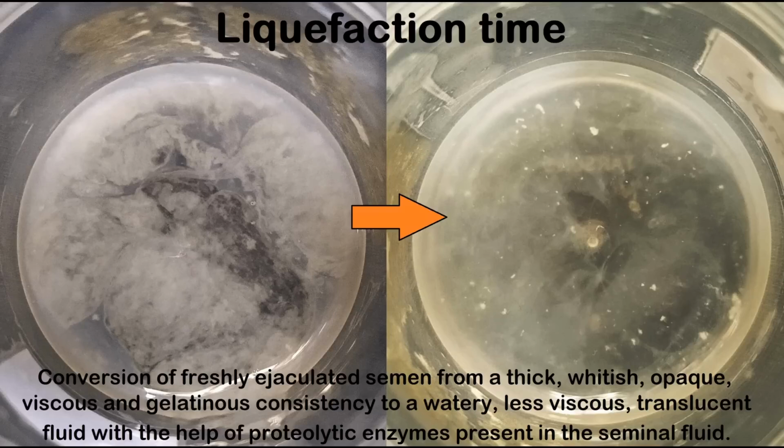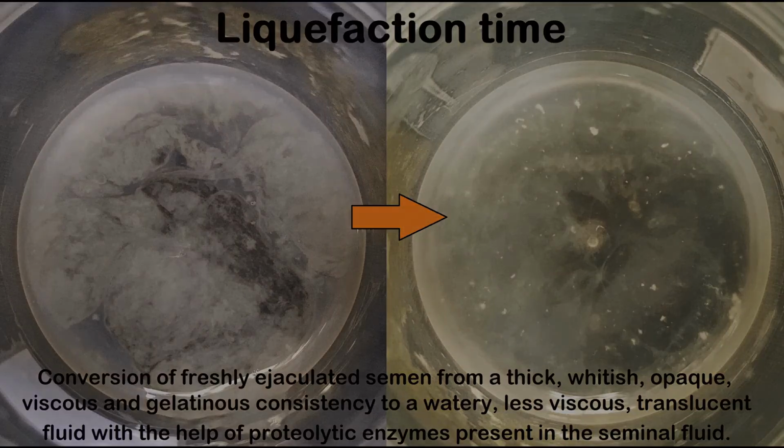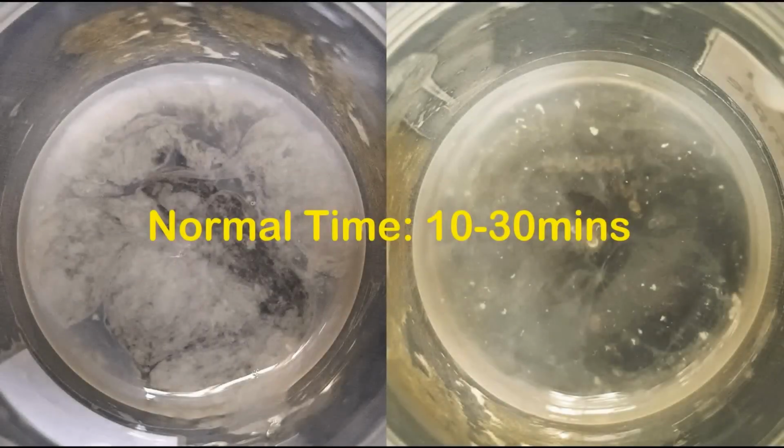To perform this test, note down the time when the semen sample was collected. Observe the semen sample and note down the time when the liquefaction is complete. The normal liquefaction time for human semen is 10 to 30 minutes. Any period of time longer than 30 minutes is indicative of infection.